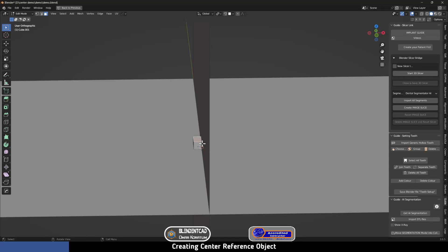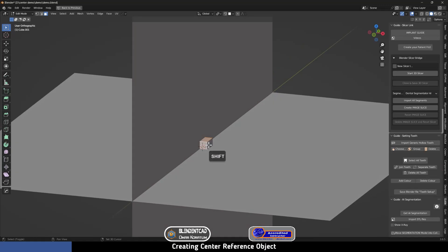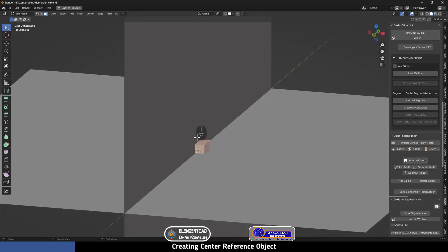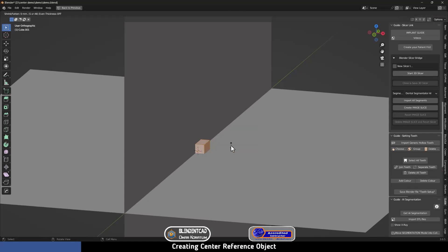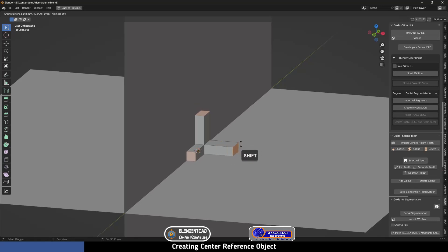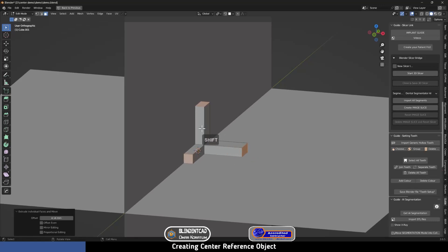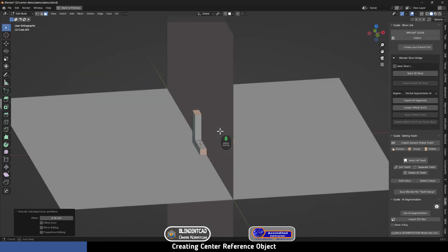I'm going to select the first face, then Shift-click to select the other faces. Then I'm going to make extrusions on these axes by pressing Alt+E to open up the extrusion menu, then select Extrude Individual Faces. Now we can make extrusions in every axis. I'm going to click to fixate it as is and then go back to Object Mode.